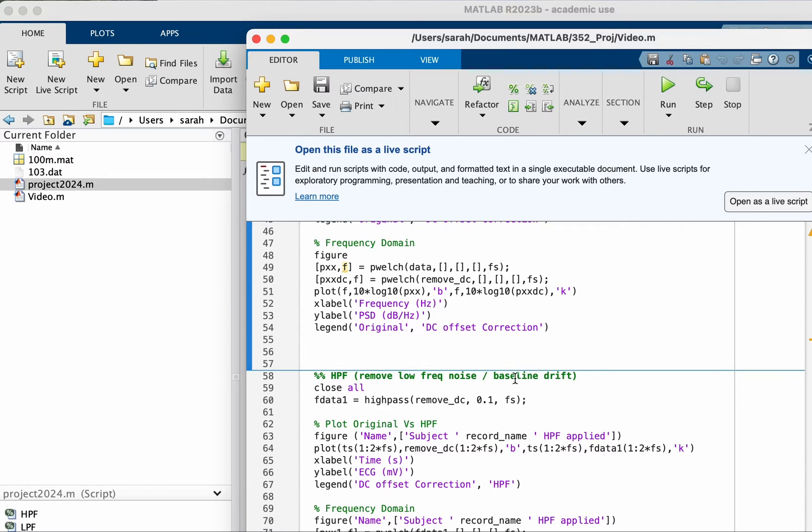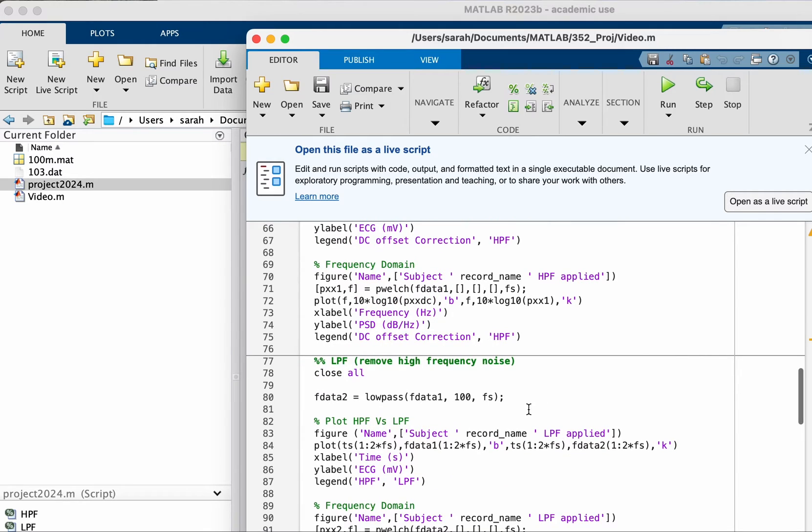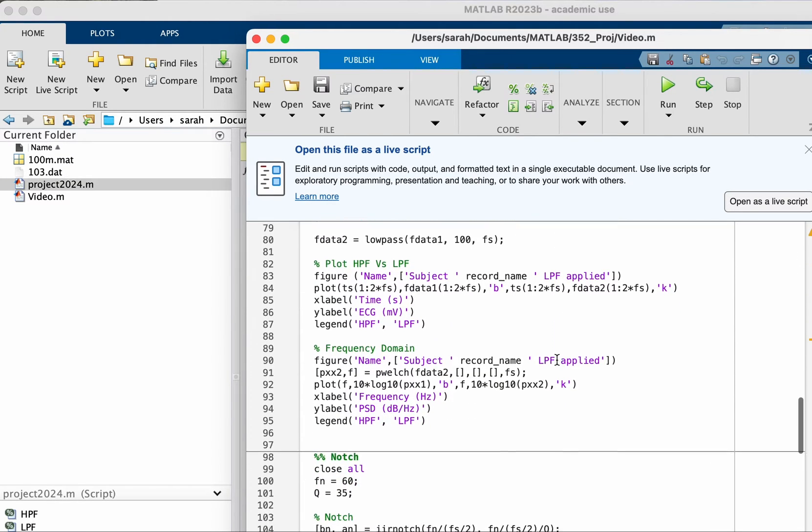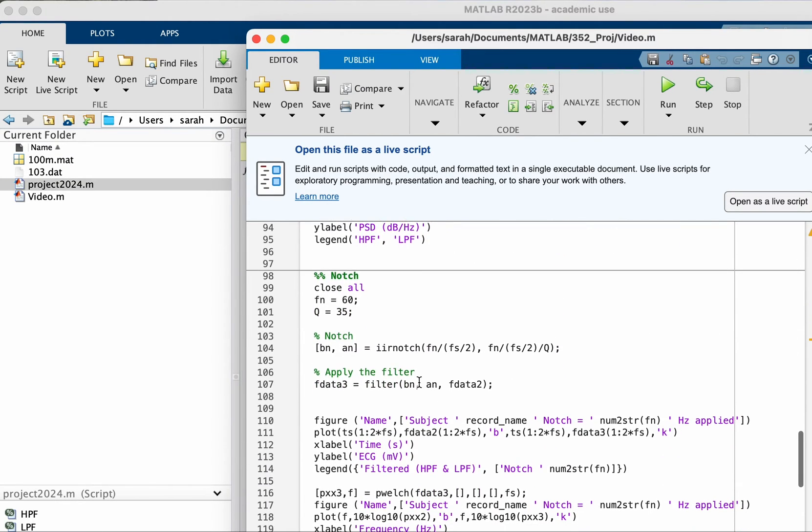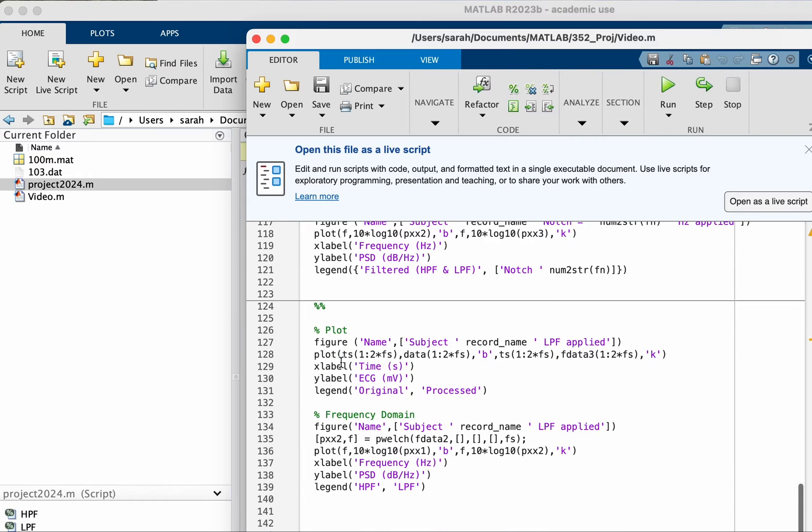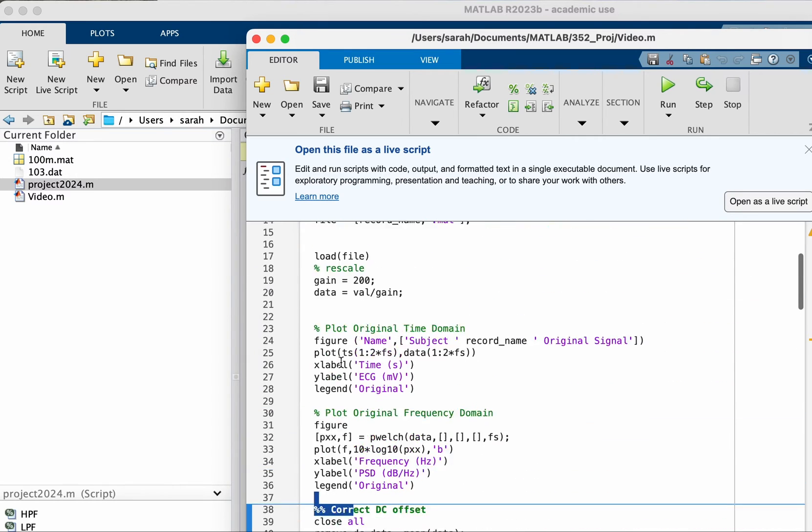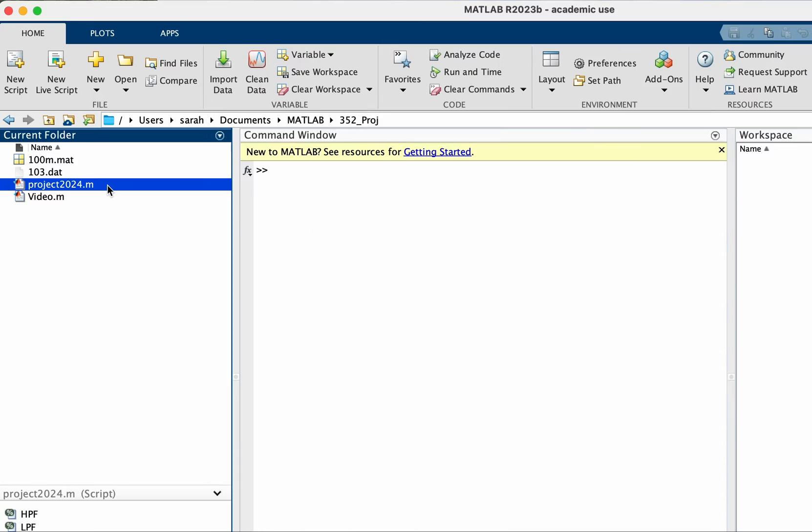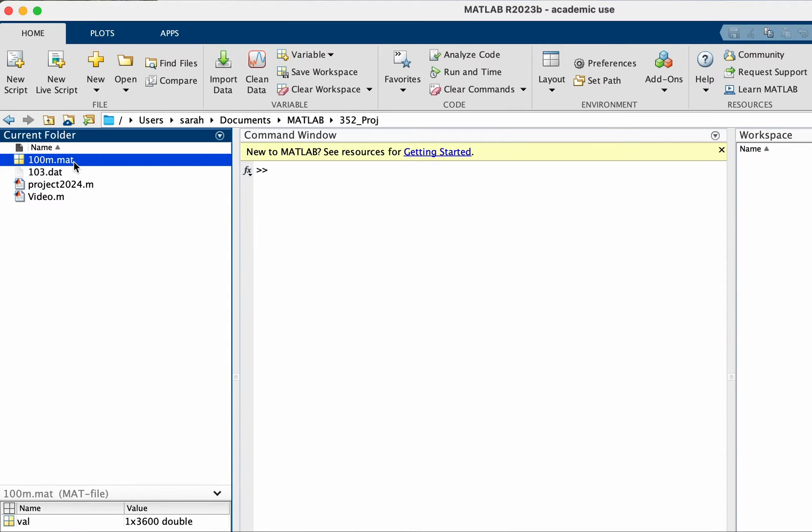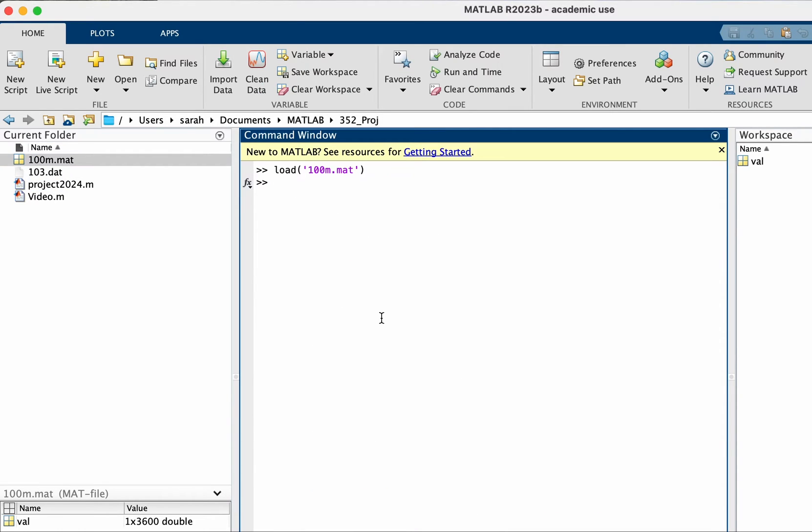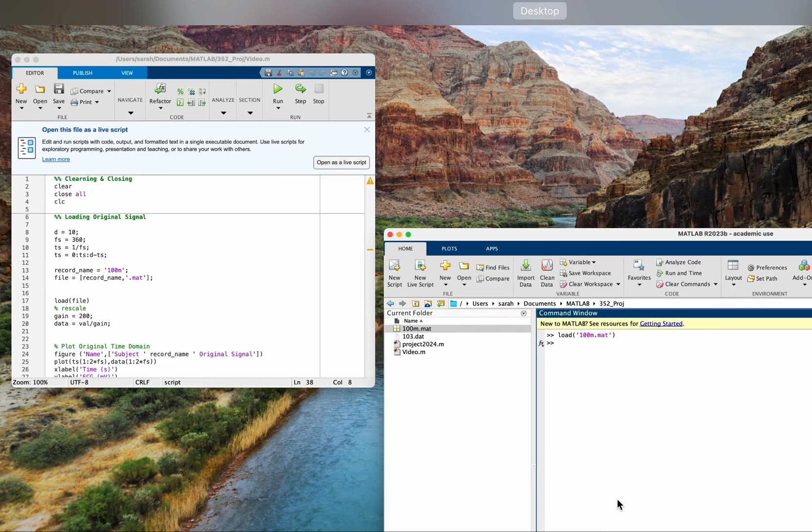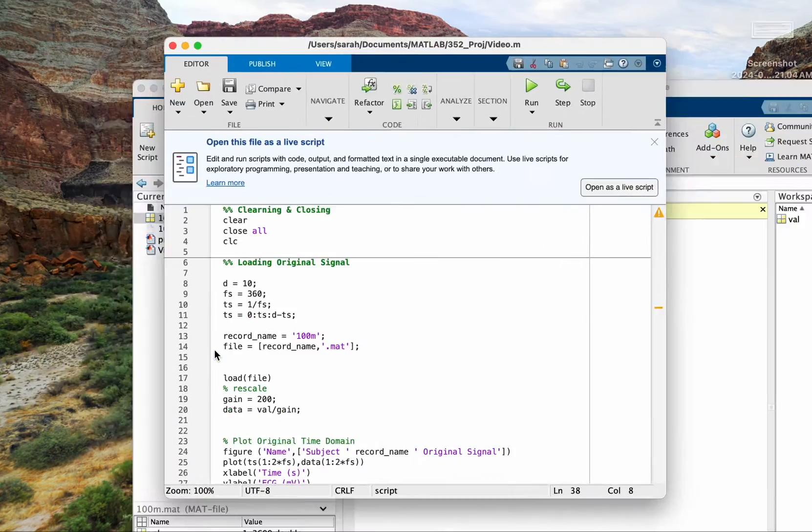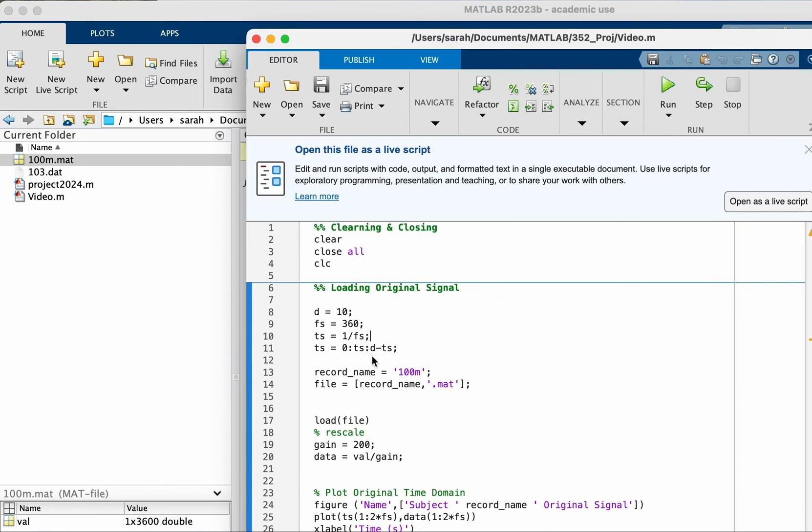This is going to fix the baseline drift and then we're going to remove high frequency noise. We'll use a notch filter to remove one specific frequency. So let's take our file and load it into MATLAB.